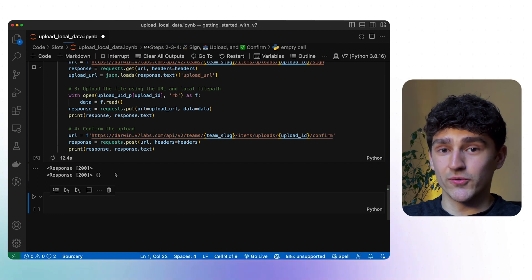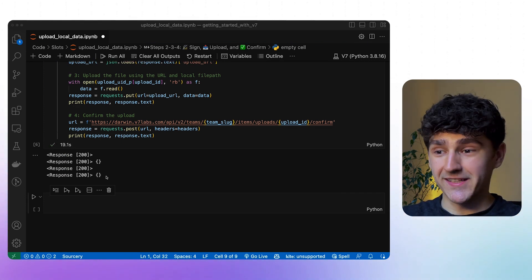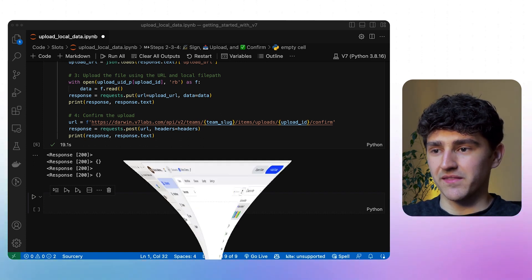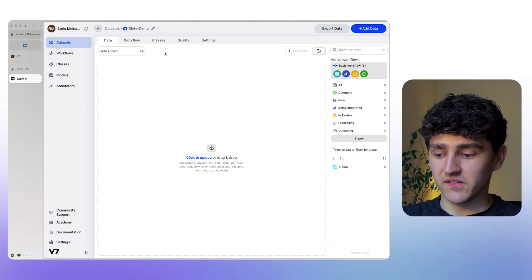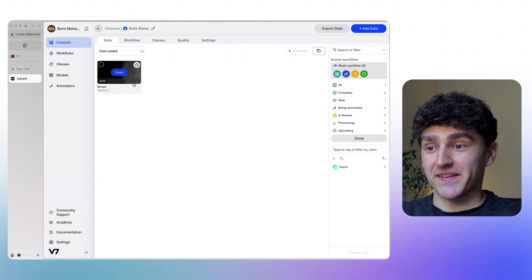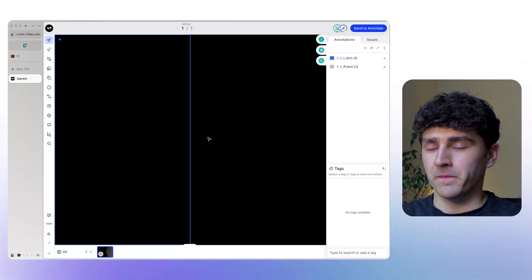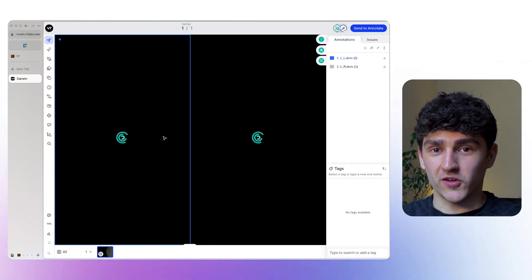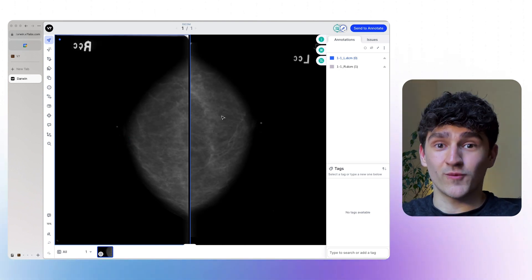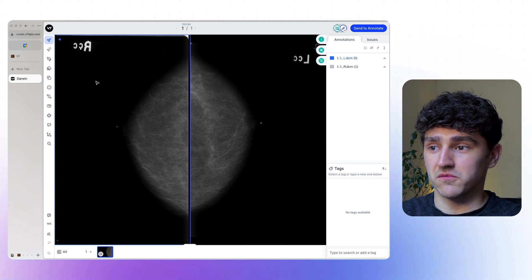Let's run the cell and we'll see two successful responses printed out — one for the upload of the file and one for the confirmation. Once done, the files are actually uploaded to the dataset. The items have successfully uploaded, so let me open the UI. After refreshing, we can see one item called breast, and opening it shows two slots with two separate images.